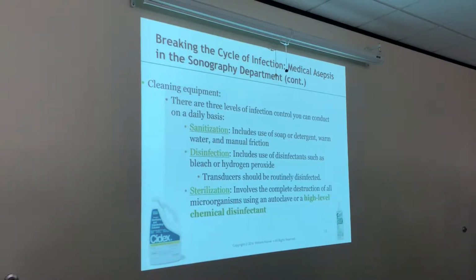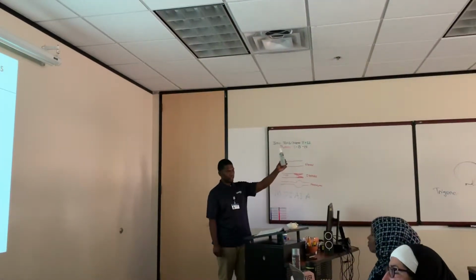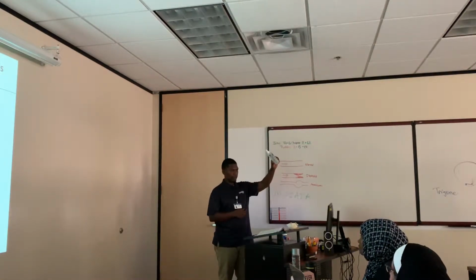Okay? The next level of infection control includes the use of disinfectants such as germicides. Some other types of disinfection would be bleach or hydrogen peroxide. Transducers should be routinely disinfected, guys. T-spray is disinfectant cleaner for ultrasound and mammography. So it's just a disinfectant because we're only using this topically, right? We're only using this on the top of some skin, right?